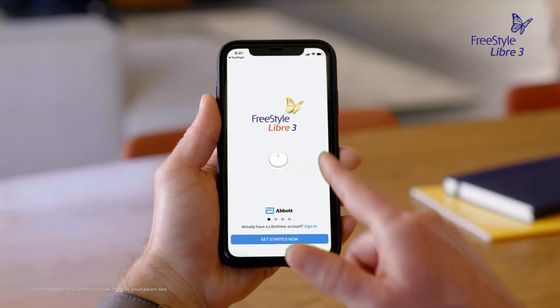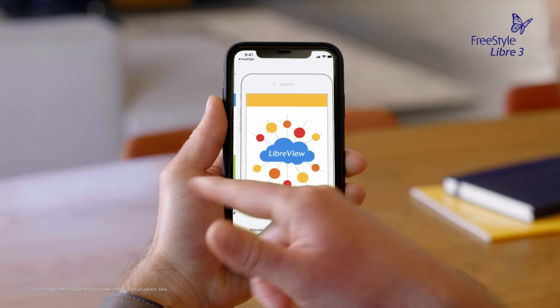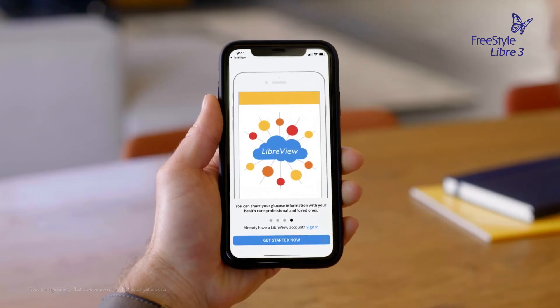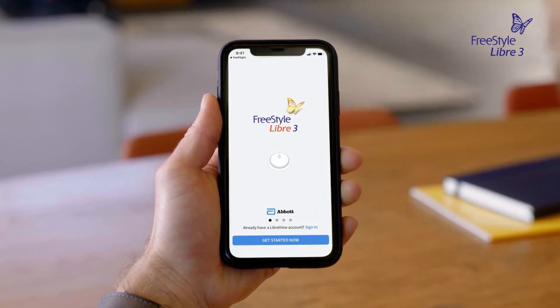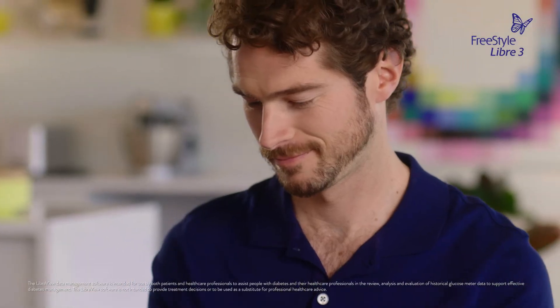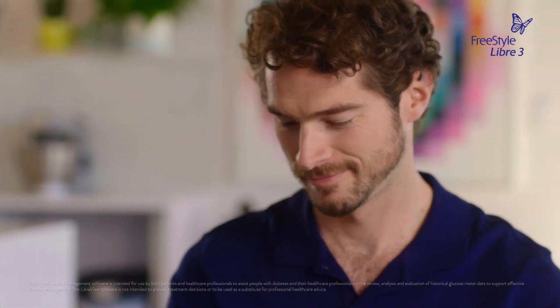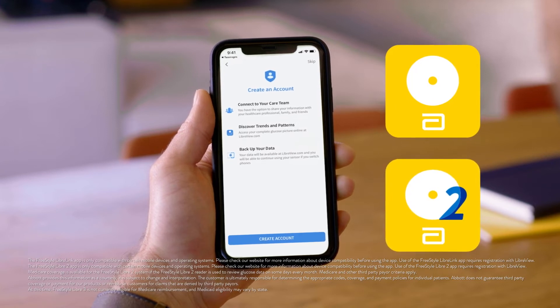Swipe left to see some helpful tips, or tap Get Started Now at any point. If you already have a LibreView account, tap Sign In, or you can create one right in the app. You may have a LibreView account if you have used the Freestyle Libre Link app or Freestyle Libre 2 app in the past.